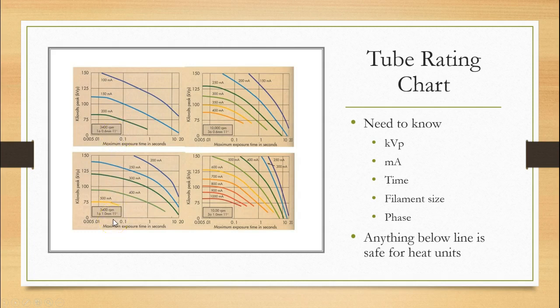So normally there's not different angle tubes, but they threw this in there. All right, so then we say, okay, if I have something at 100 kVp, and I need to know, is it safe to make 100 kVp at 75 mass? So here, 175, 100 at 75. So we're looking here. So, I'm sorry, let's do that again.